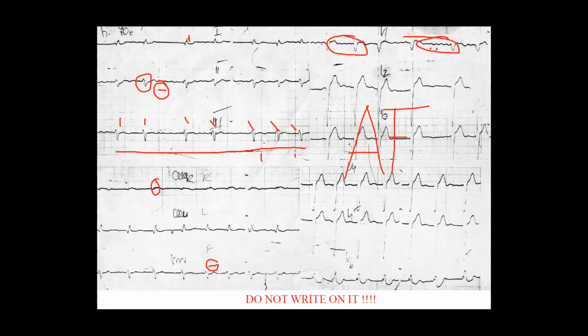It's much easier to discover atrial fibrillation based on the pulse than looking at the ECG, because if you're looking at the ECG, you are trying to find a P wave and you want to force yourself that it can be a P wave, because sometimes we see a very small P wave, but that's rhythmic. If you do have sinus rhythm, that's rhythmic. If it's arrhythmia and you do not see a nice discrete P wave, say it's atrial fibrillation.